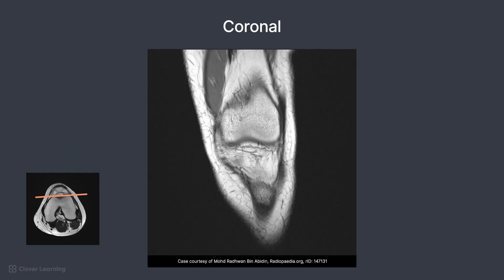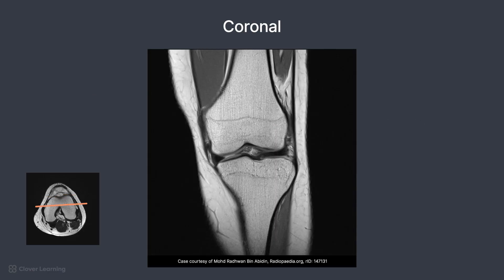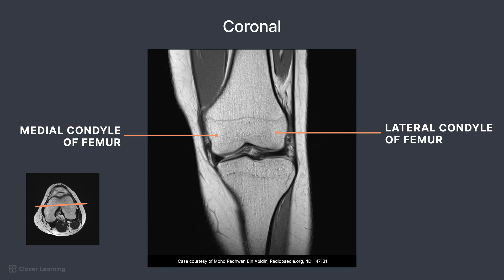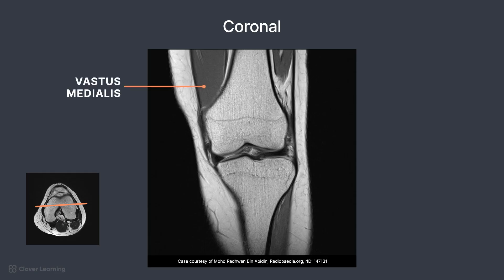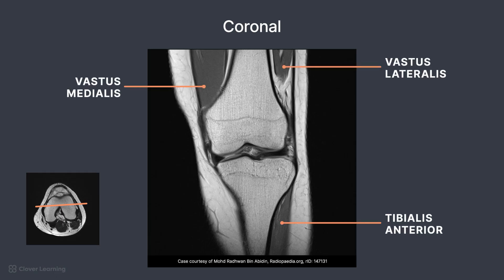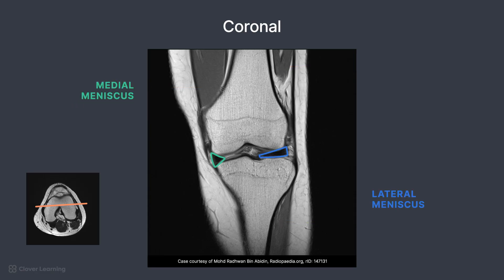Moving posteriorly, the femur emerges with the vastus medialis muscle. Arriving about halfway through the knee joint, the medial and lateral condyles of the femur and the tibial plateau are visible. Muscles demonstrated include the vastus medialis, vastus lateralis, and tibialis anterior. The medial and lateral menisci are seen here, again in a somewhat triangular shape.